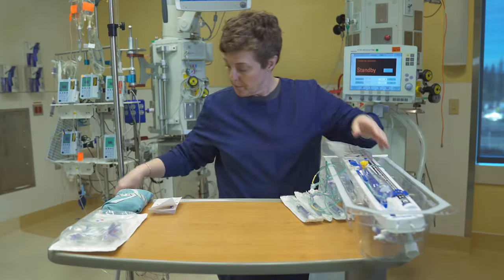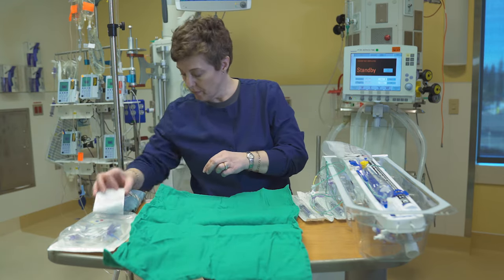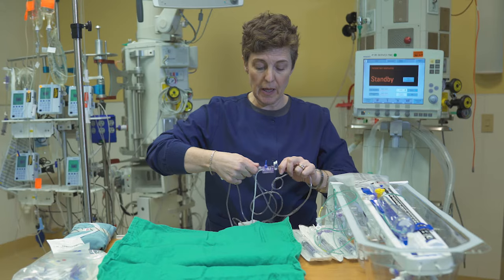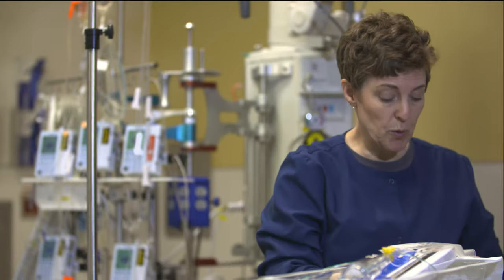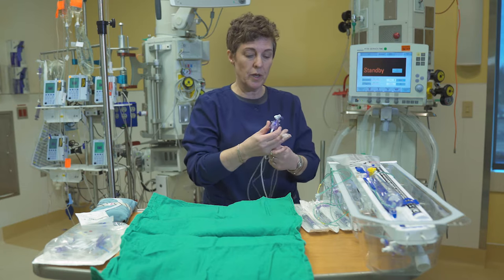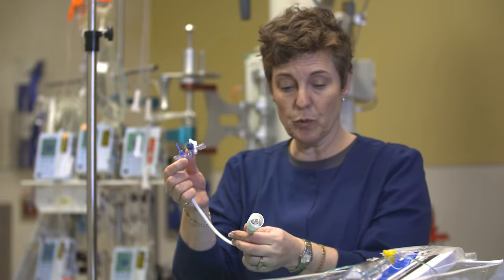I'm going to open up my hot towel first — just gives myself a clean area to work within. Now I'm going to prepare my pressure line. You're going to remove both ends of the pressure line so that all that you're left with is the transducer. Dispose of those pieces, so that all that remains is the transducer and the pressure cable that you will plug in to go to your monitor. Those are the two important pieces you're using.